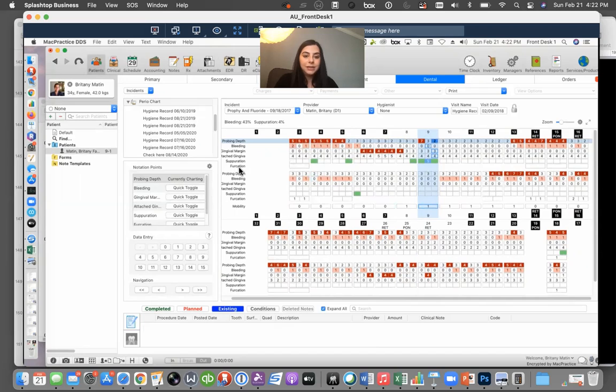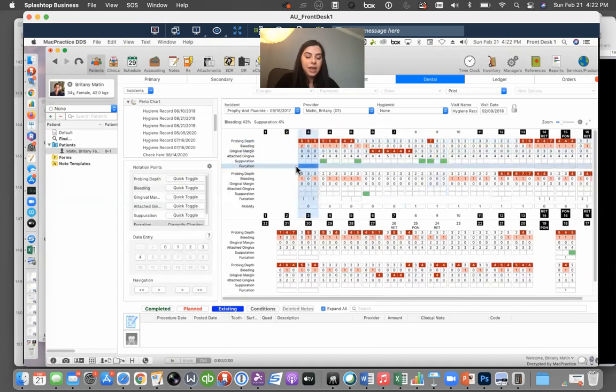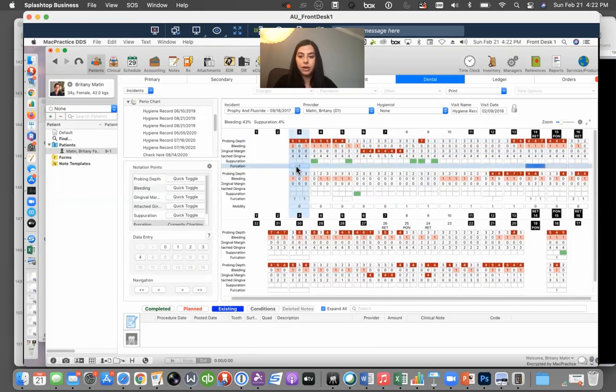Another thing that we will look at is the furcation. That is the area in between the roots of the maxillary and mandibular molars. They have multiple roots, so they split like this. And sometimes there is bone loss in between those roots. So we are measuring the space of that, or the amount of that bone loss. That is measured by this line, which is called furcation. So you can select those boxes, and it can be class 1, 2, or 3. Sometimes we skip around and tell you which teeth because they don't all have furcations. So we'll say the buccal of number 3 has a class 1 furcation. The mesial palatal of number 14 has a furcation, class 1. So you just need to follow along when we're choosing those furcational areas.